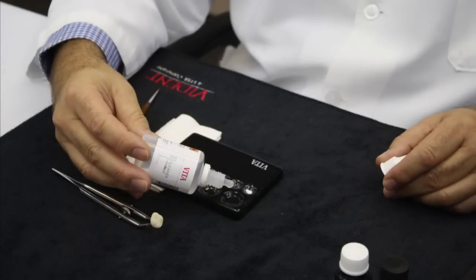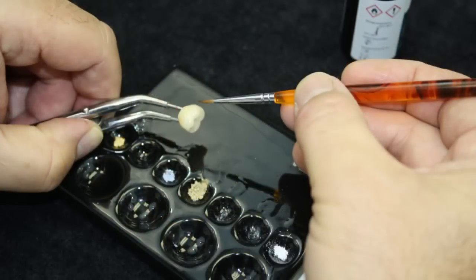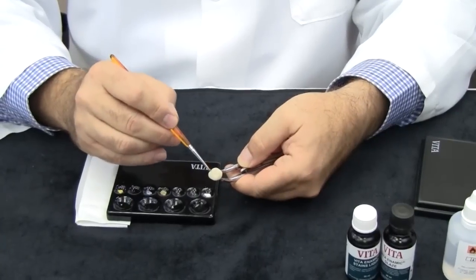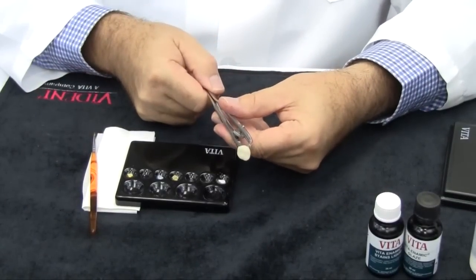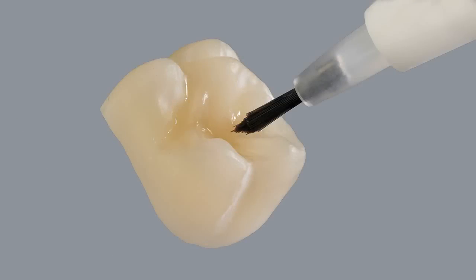It is recommended to dispense the Vita VM-LC cleaner into the mixing plate and, using a clean brush, wipe the entire surface of the crown prior to the next step of application. The cleaning solution will then evaporate in a matter of seconds and can also be air blasted to speed up the process. Use internal crown forceps or hemostats to securely hold the crown. Now apply silane or ceramic primer sparingly to the entire surface of the crown to be stained and glazed. Allow to dry carefully, or use compressed air with caution to speed up the process.